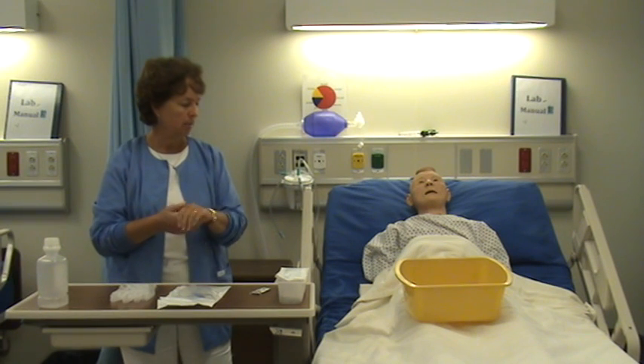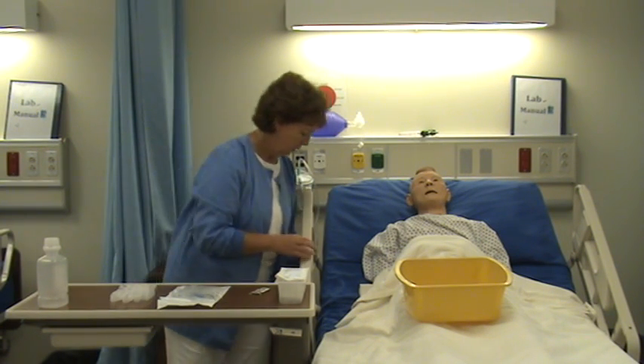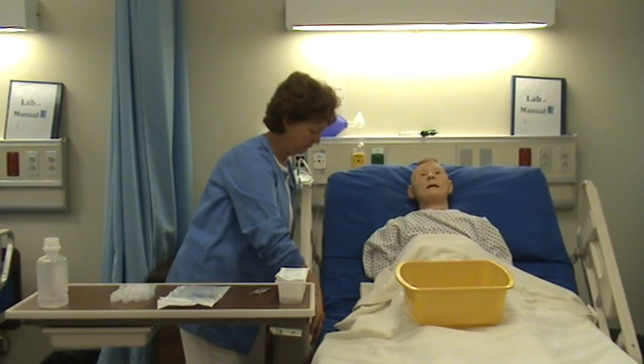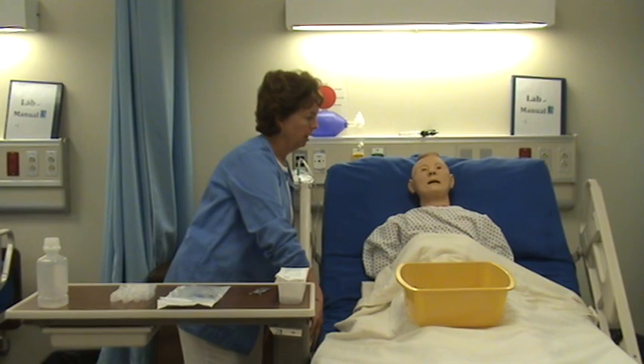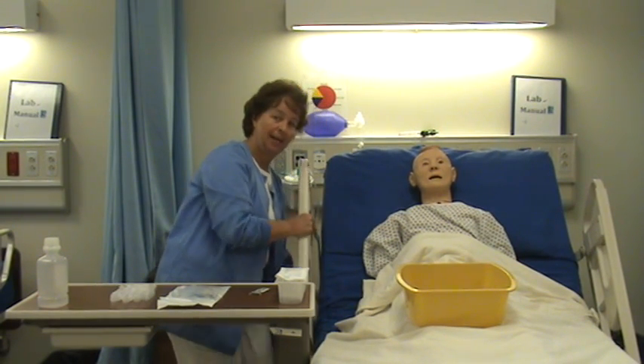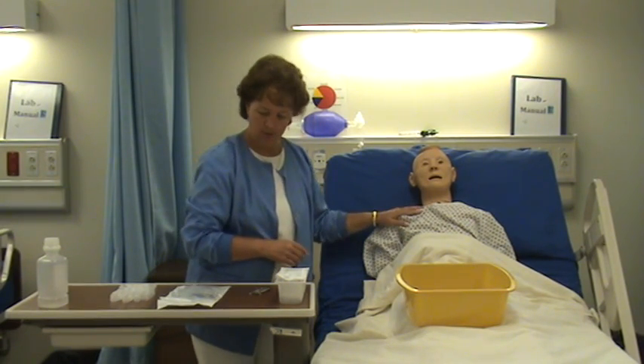I've come in and washed my hands, already identified the patient, and reviewed the order. I'm going to sit him up straight and spend a lot of time explaining what I'm going to do, because this is an uncomfortable situation that will definitely cause some anxiety.